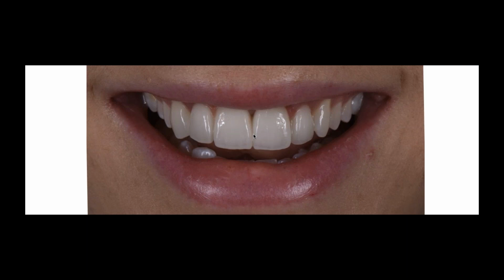I really believe I can make a metal ceramic frame look just as good as a zirconia frame, maybe better in some scenarios, maybe not as good in others. There's no flat rule that it's always this or always that. It really depends on the case, the environment, and what we're working with as our prep shades and our information.